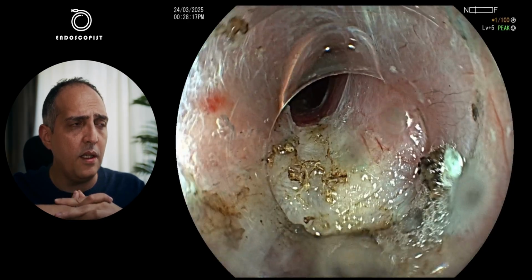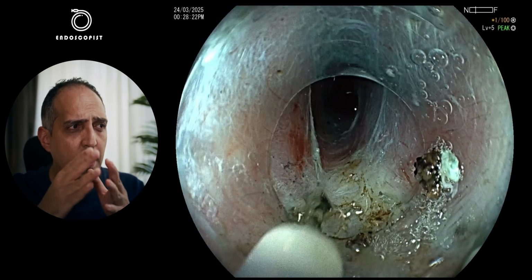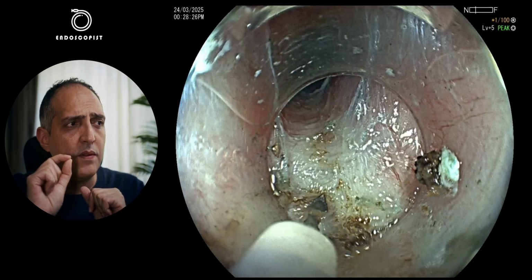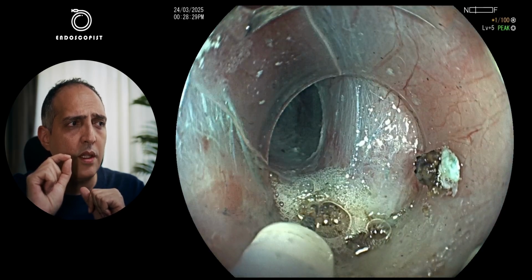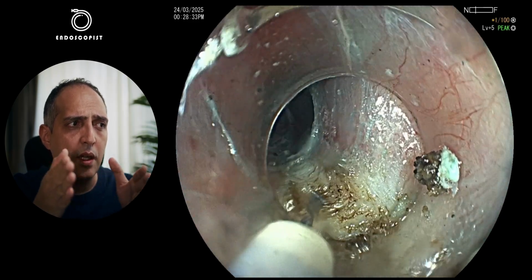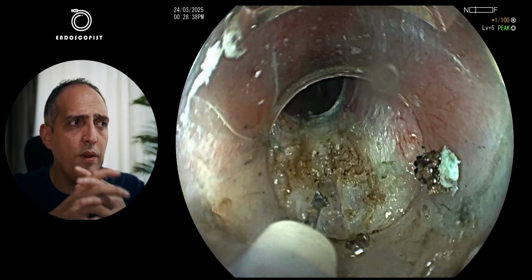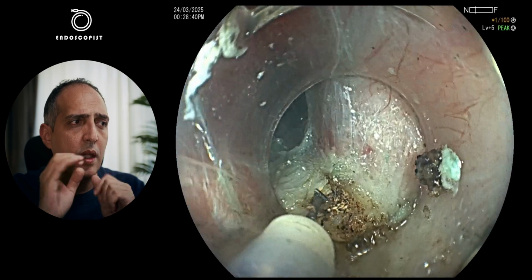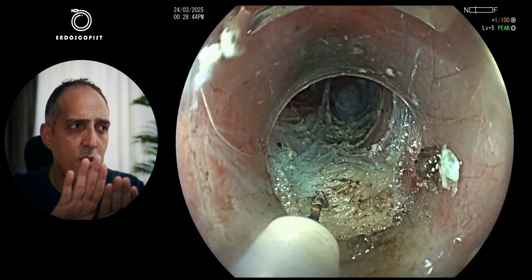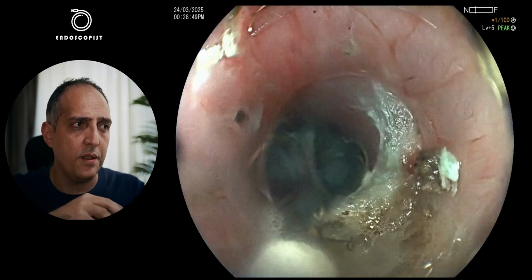So this is again the area just above the cardia. So it's a tight space. So what I do here is I go out with the tip of the knife and I give spray coagulation, again non-contact, and the fibers will separate from each other. I will have a very nice and precise myotomy at this area with minimal coagulation. Again, I'm using the cap to put pressure or traction on the muscle fiber, so that will allow for a very nice and smooth separation when I give current.